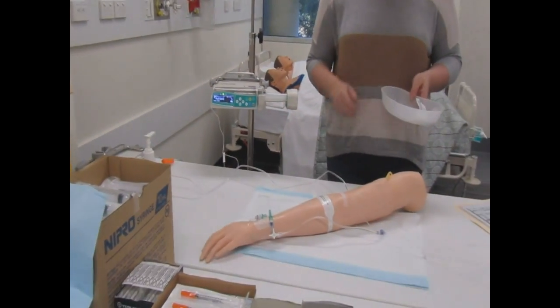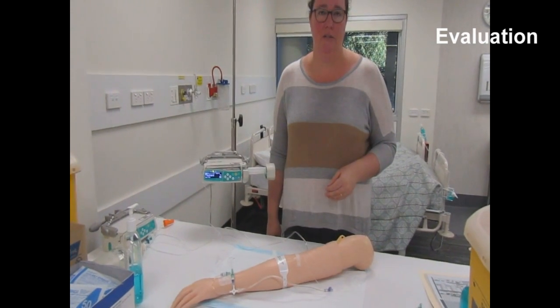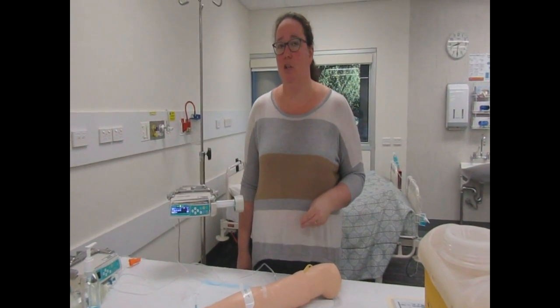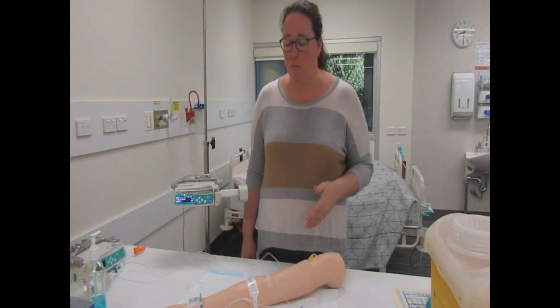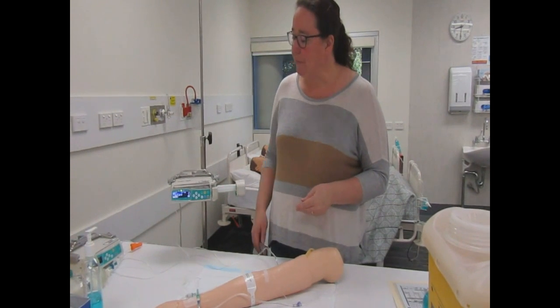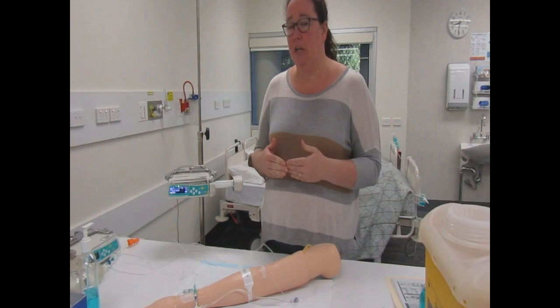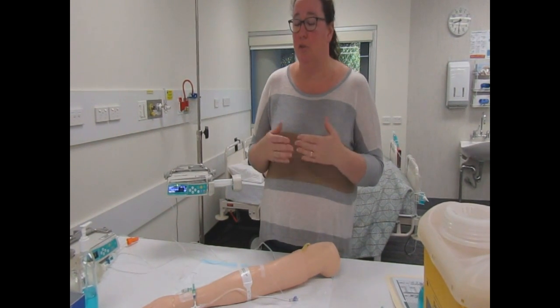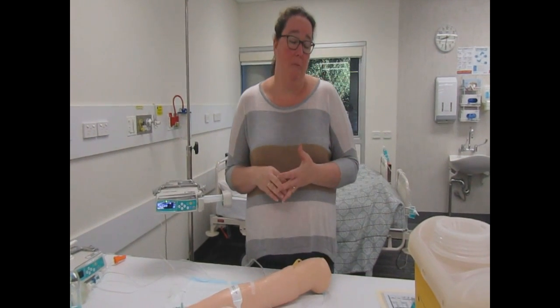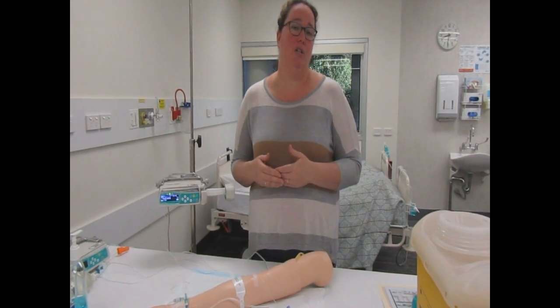With the insulin infusion now going, it is my responsibility as the nurse for this patient to continually evaluate his condition. That means looking at his IV site on a regular basis for any signs of infection, leaks, or a compromised dressing; making sure he understands that if he wants to go for a shower it needs to be covered and secured well; checking his BGL on an hourly basis as per the orders and adjusting the insulin infusion rate depending on that BGL, ensuring a second RN is present. As a student, you'll need two RNs present if you need to change the infusion. Also making sure the patient and family's knowledge is up to date, addressing any questions or concerns, and checking in with them at all times.